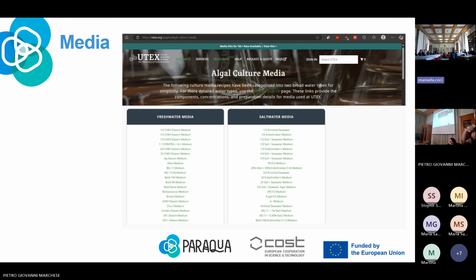Actually, we have different types of media we could use, but if you want, you can prepare the medium recipe yourself. In most of the culture collections, there is only one, but you can find other recipes in other types of culture collections.